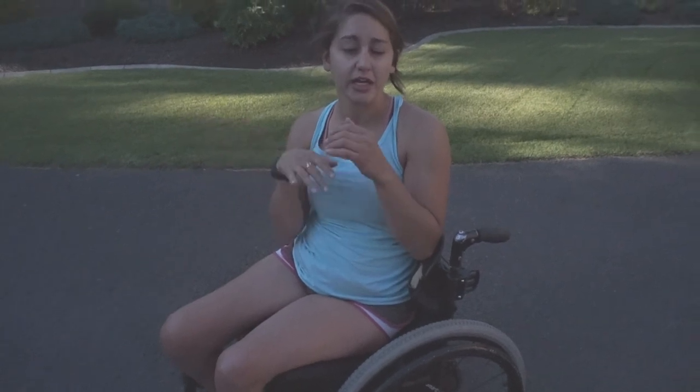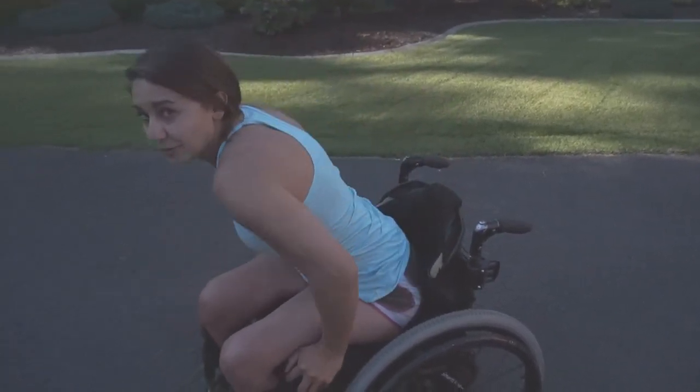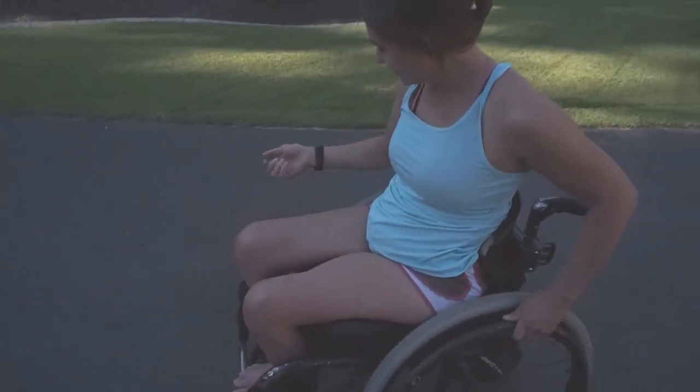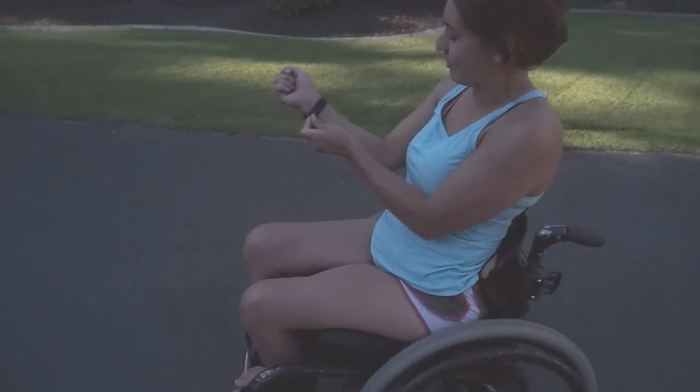I'll go ahead and show you how I just push and it starts, and then how it will get me up a hill without me having to help it at all. Here we go — and I hate this thing that already came off.